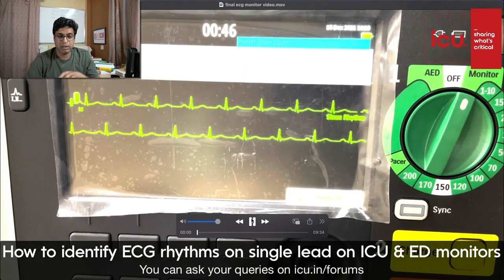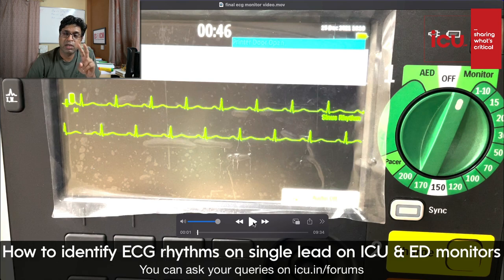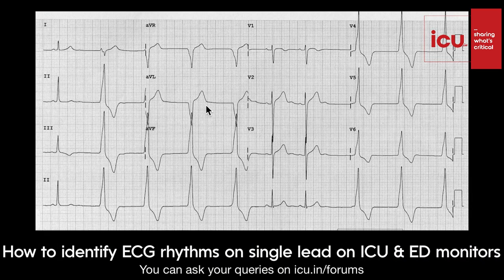Okay, so these were the rhythms on the monitor, on the simulator. Two rhythms we missed, and one of them is very important, I'd like to tell you. Okay, so this is idioventricular rhythm, accelerated idioventricular rhythm. Basically for a ventricular rhythm, if it is less than 50, we call it ventricular escape rhythm, and if it is more than 100 or 110, we call it ventricular tachycardia. These rhythms are originating in the ventricle. If they are between 50 to 100, then we call it accelerated idioventricular rhythm. Usually it is seen in reperfusion when you thrombolyze an MI with any thrombolyzing agent. There you see this accelerated idioventricular rhythm.